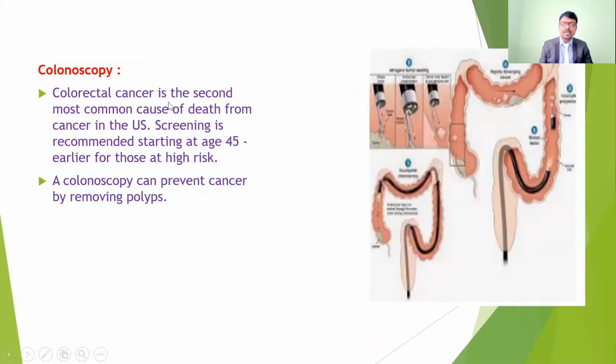This type of complication more commonly arises after 45 years. But nowadays, because of unhealthy lifestyles, many people are facing colorectal cancers and also gastric abnormalities. We can identify colorectal cancers, or any polyps present inside the colon, with colonoscopy.